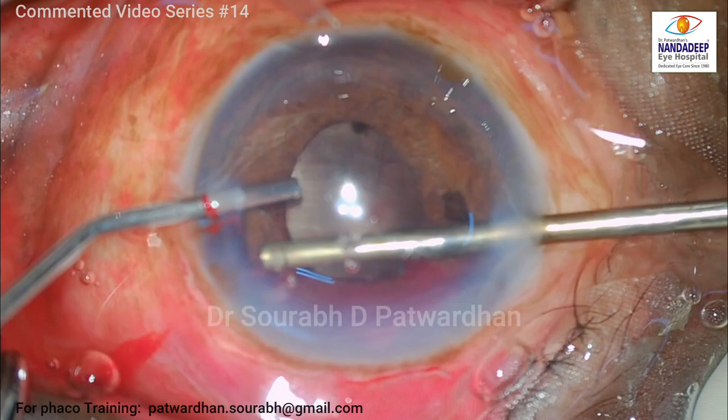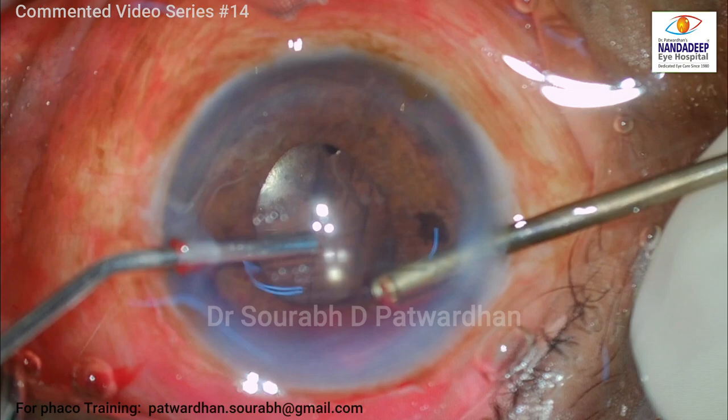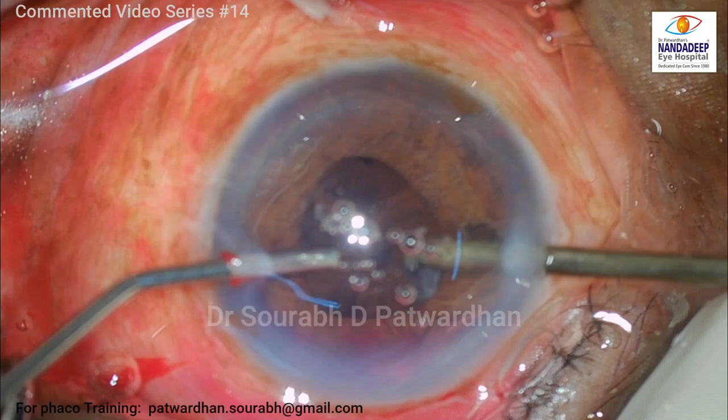I am keeping the port, or the opening of the vitrectomy probe, towards the cornea so as to avoid injury to the iris. I am cutting off the hyphema or the clot without pulling it from the angles from where it has bled. The idea is to debulk this clot as much as possible. A little bit of clot that stays adherent to the angle, we can let it stay — it will get absorbed over a period of time.